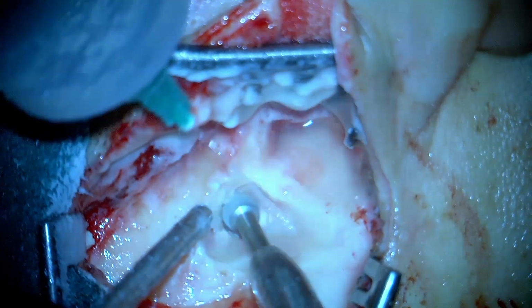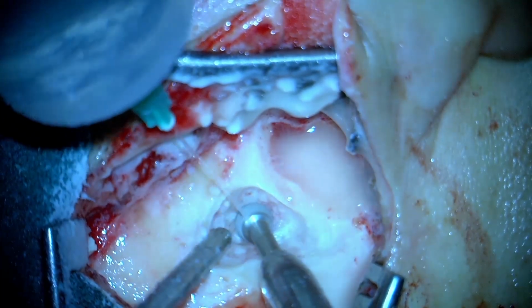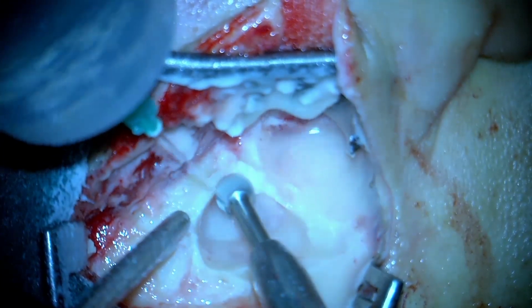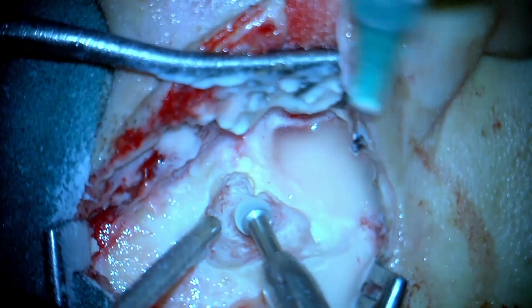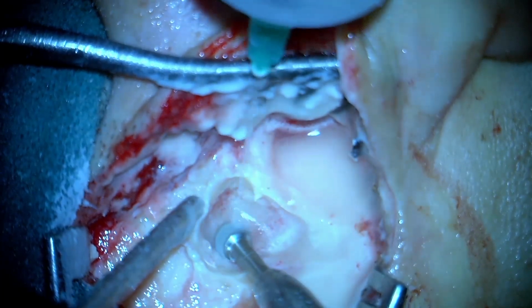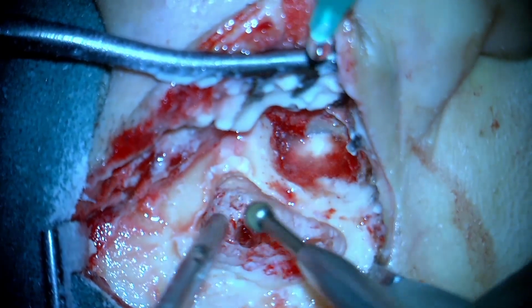So we initiate our surgery by doing a standard cortical mastoidectomy. We have to see what the contents of the mastoid antrum are, that soft tissue opacification that we saw on the CT, whether that is really cholesteatoma, or just some edematous mucosa, which could very well be the case. And that would definitely add to our attempts to safeguard the canal wall and not take it down.